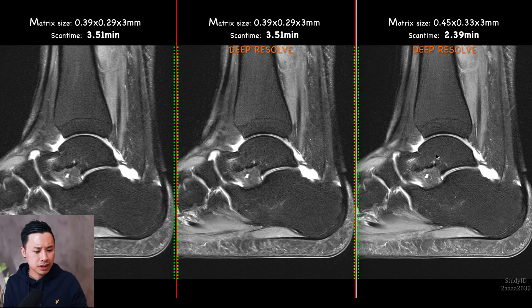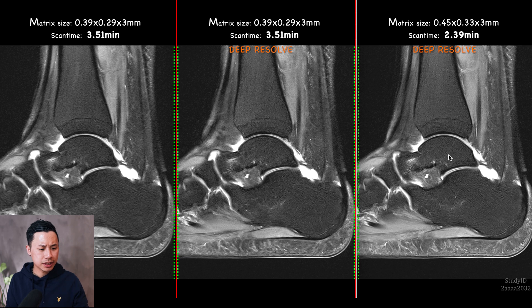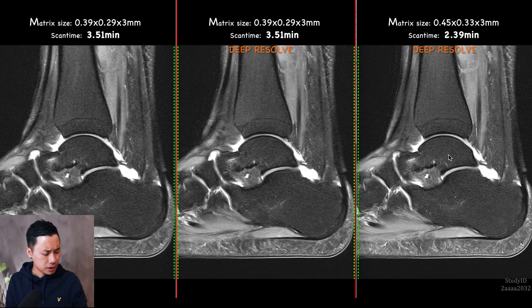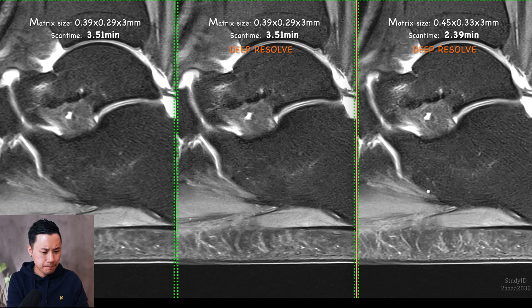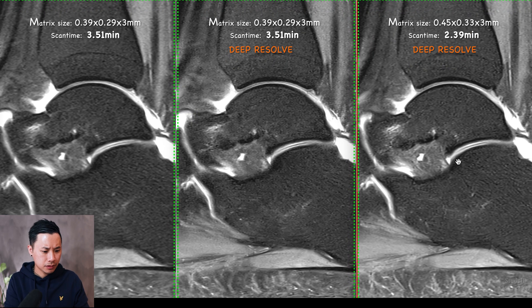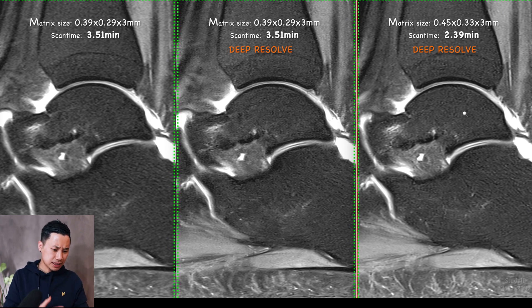The last one has a slightly lower resolution as you can see — the voxel sizes are a little bit bigger — but the scan time is lower of course. So these two: 3 minutes 51 versus 2 minutes 39. Let's check the images. For me, it seems that this shorter scan time with Deep Resolve, with the settings we're using here, looks sharp.